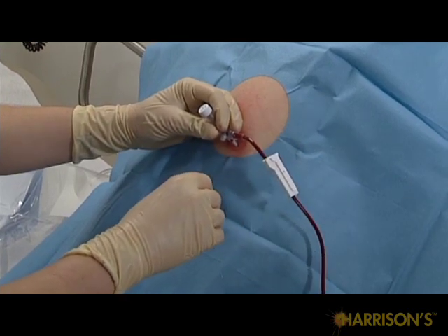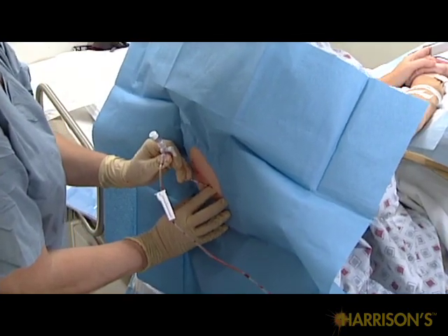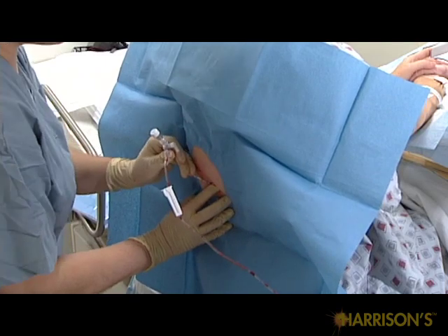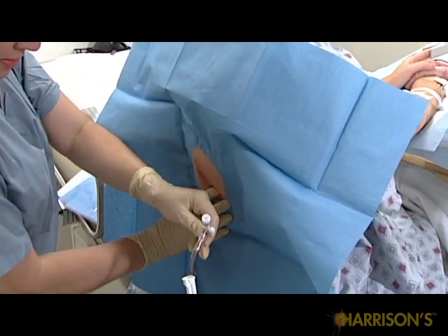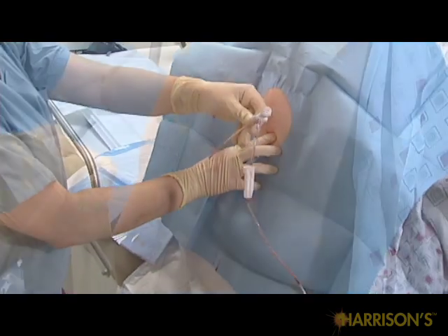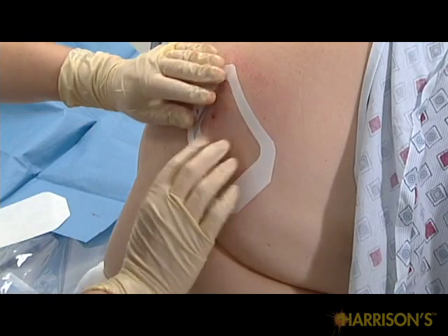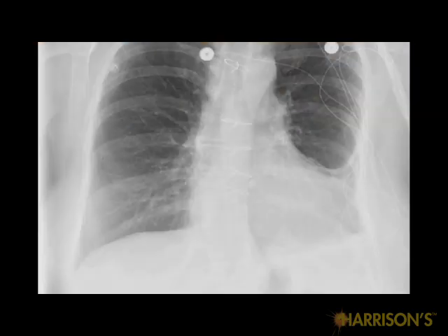pleural space. Once the space is drained, withdraw the catheter while the patient takes a deep breath and performs a Valsalva maneuver, and cover the exit site with an occlusive dressing. Obtain a follow-up chest X-ray to ensure the patient does not have a pneumothorax.